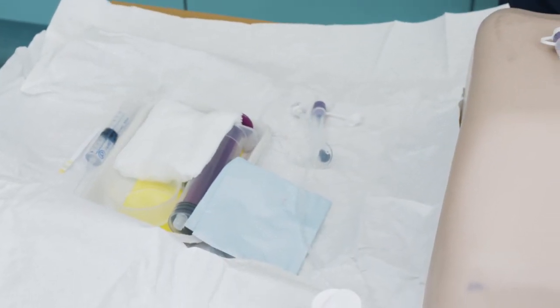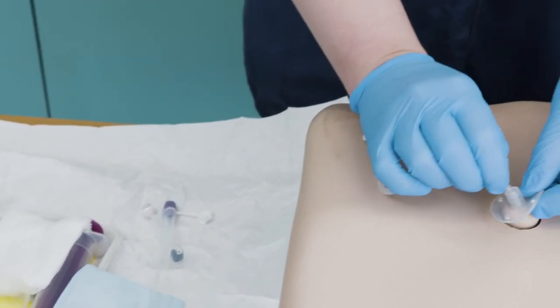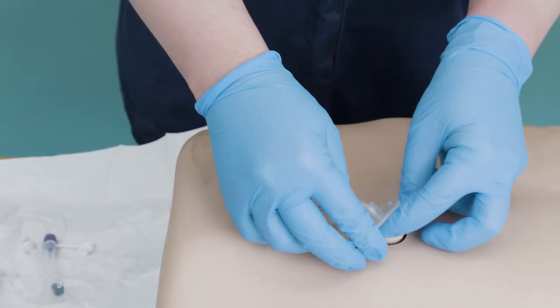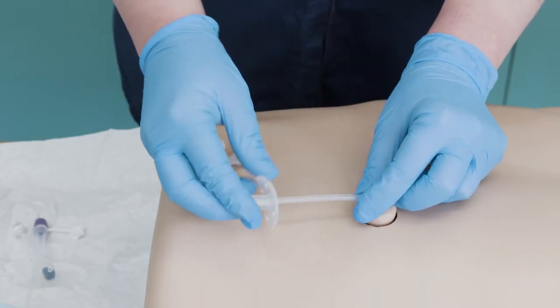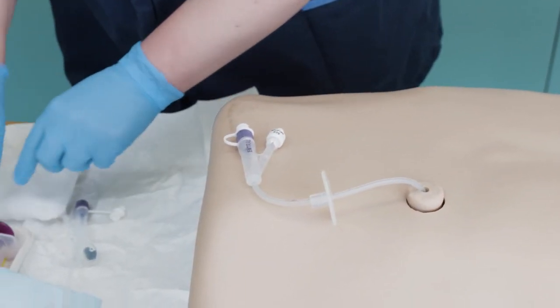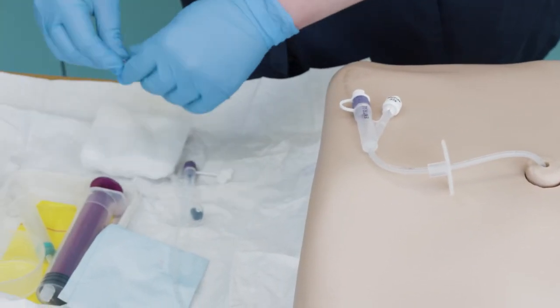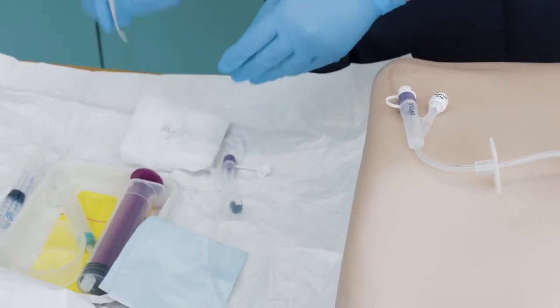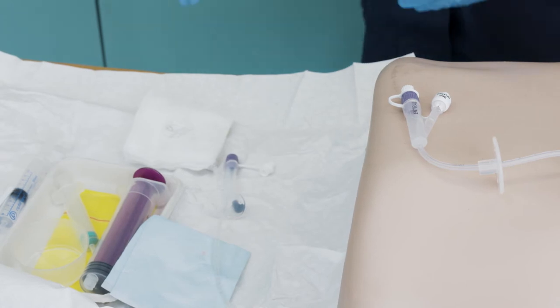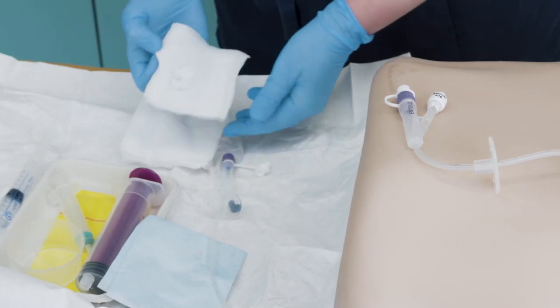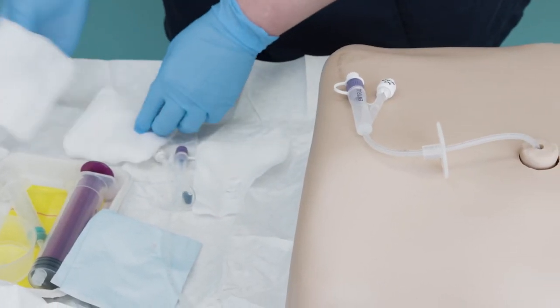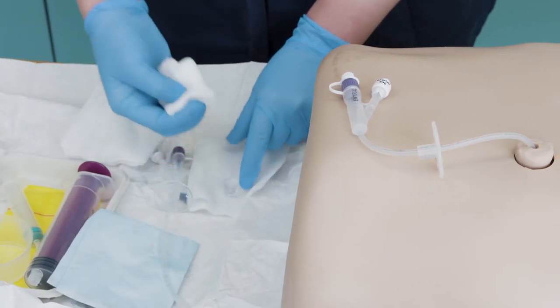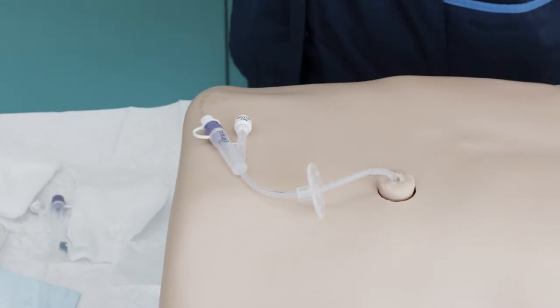Lubricate the stoma site and loosen the external retention device, and advance the tube in and out of the tract to check it moves freely. Please note this will only be possible when using a balloon gastrostomy tube.